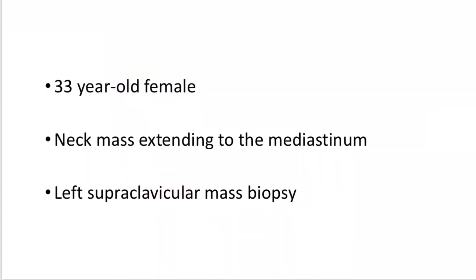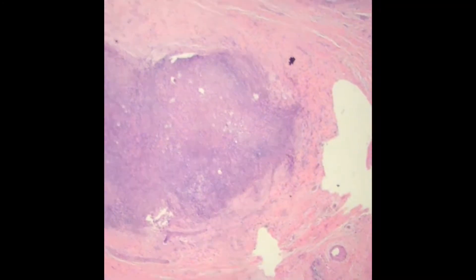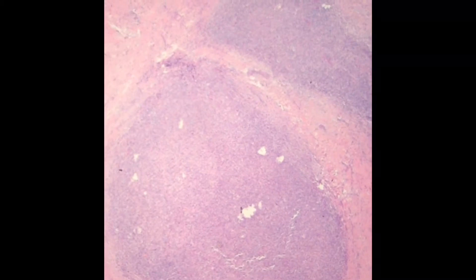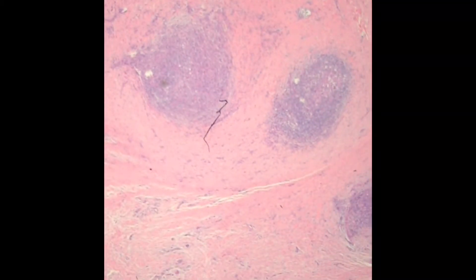Today I want to show two cases of Hodgkin lymphoma, starting with a case of classical Hodgkin lymphoma. This came from a 33-year-old woman who presented with a neck mass that extended down and included some mediastinal lymphadenopathy. On really low power, what you can see is that the architecture of this lymph node has been completely effaced, with little nodules interspersed between really thick bands of collagen fibrosis — a nodular effacement with extensive sclerosis.